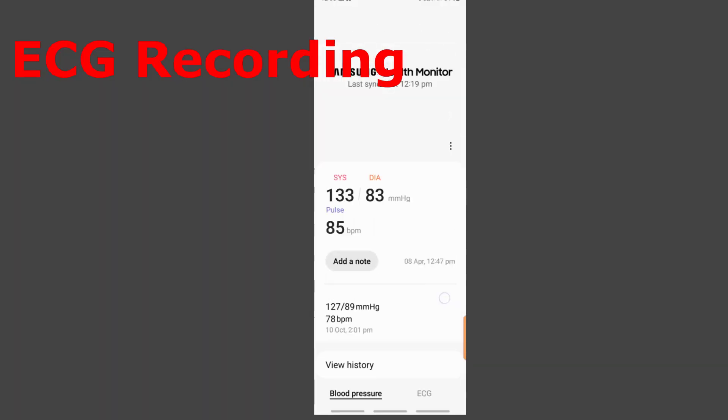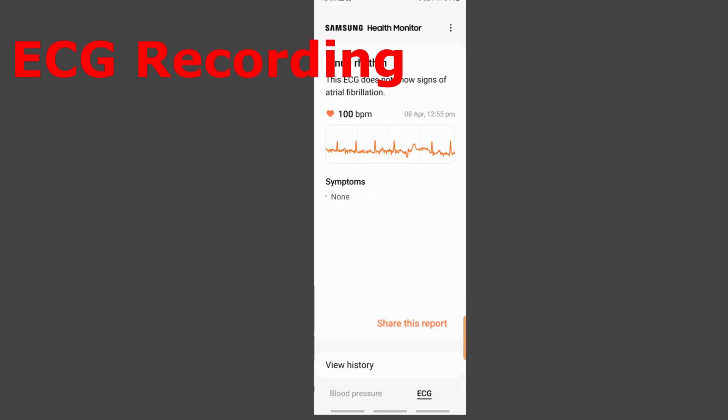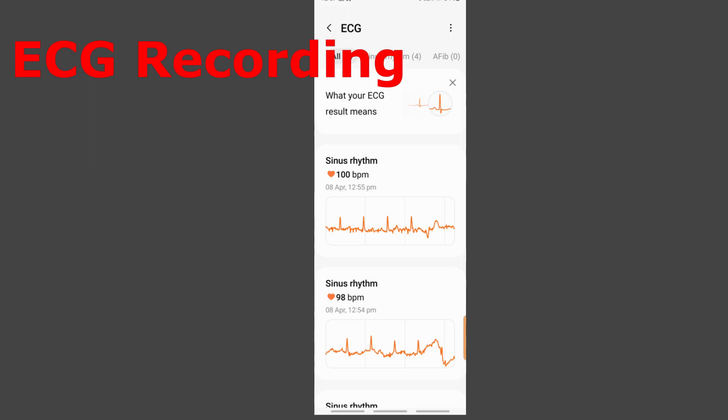Back in the Samsung Health Monitor app, clicking on the ECG recording shows today's ECG with my heart rate as 100 beats per minute, no symptoms recorded. I can share this report — clicking share allows you to send it via WhatsApp, email, or messenger. Under view history, I can see all my previous readings — in this case two readings taken one after the other.